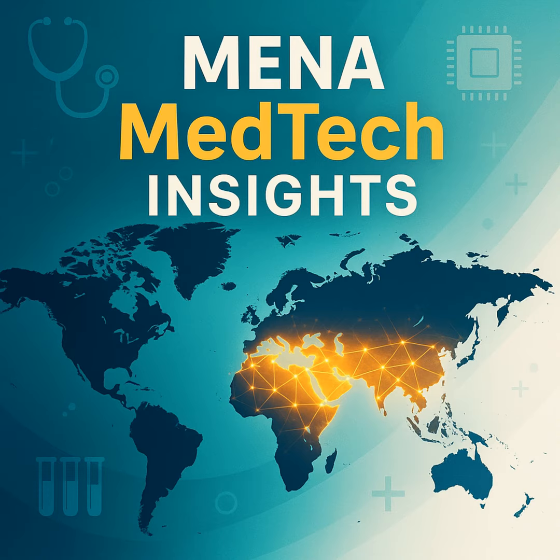Finally, Class D is reserved for the highest-risk SaMD. This would be software that controls a life-sustaining device, like the algorithm in an automated insulin pump or a controller for a cardiac defibrillator. A failure in Class D software could be fatal.